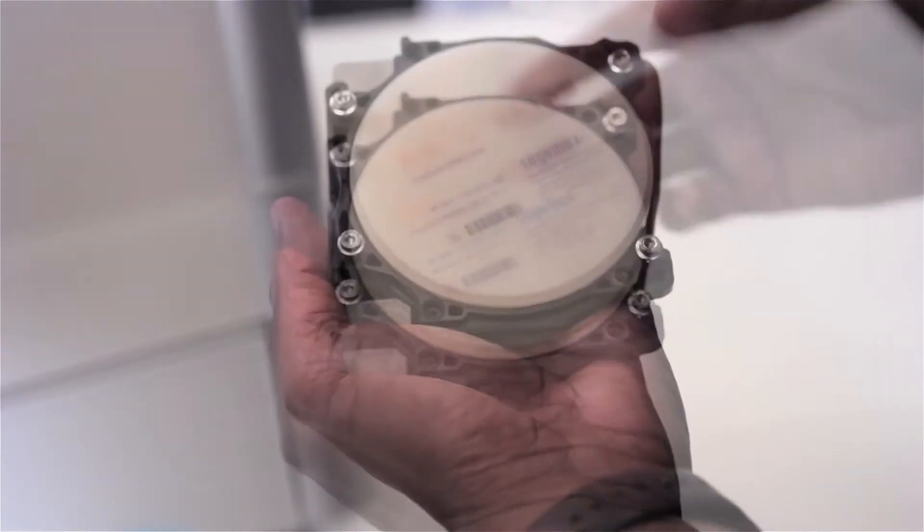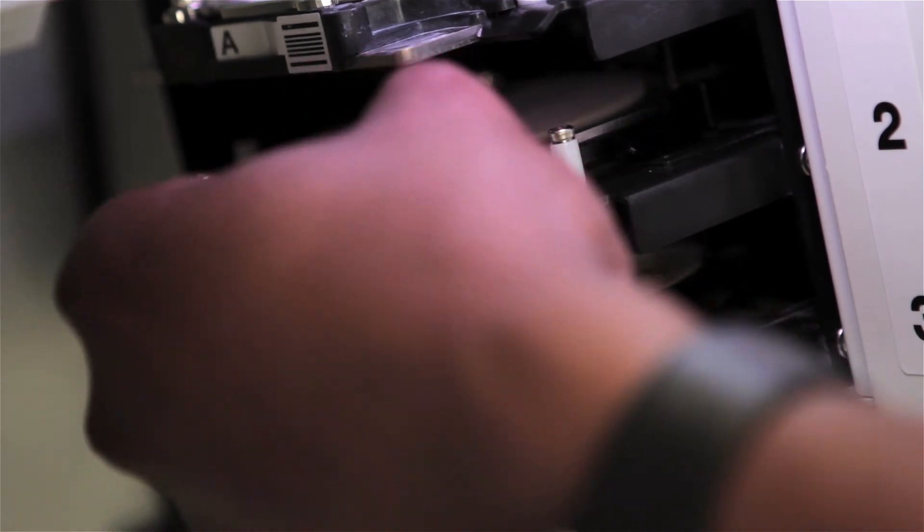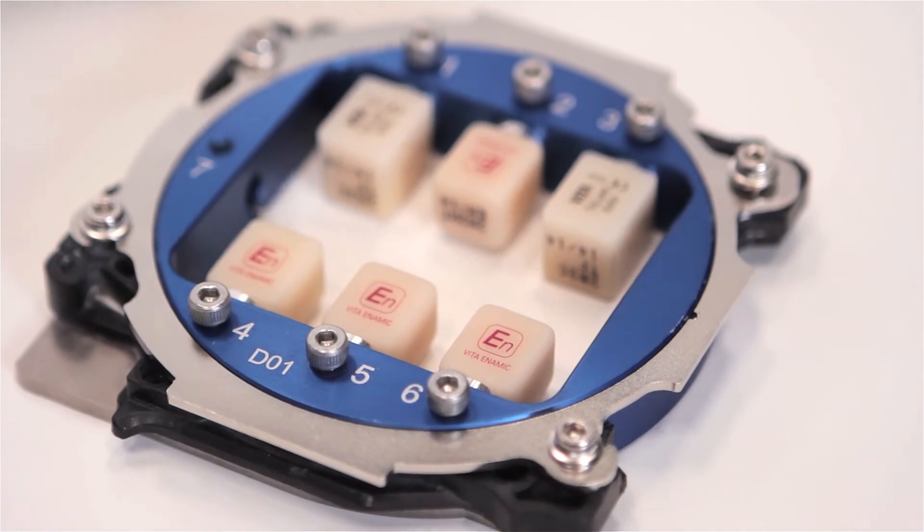Loading materials into the DWX52DC is also made simple with our O-Clamp system, saving you time when setting up milling jobs for discs and pin type materials with an included pin type adapter.